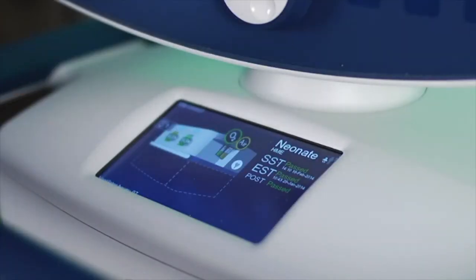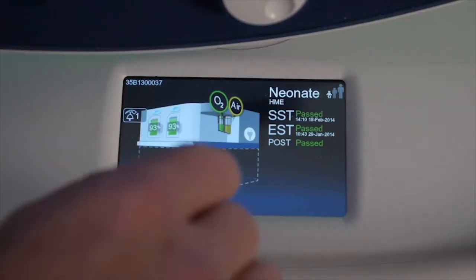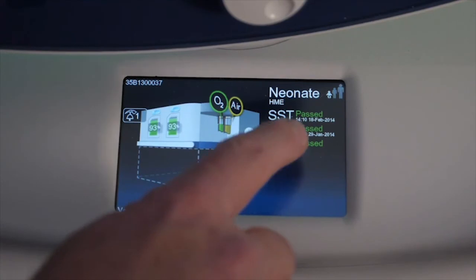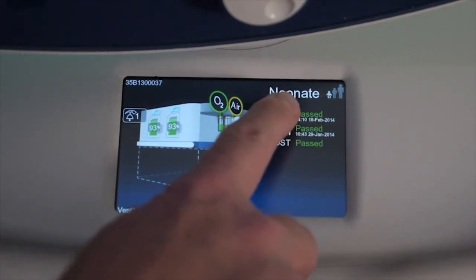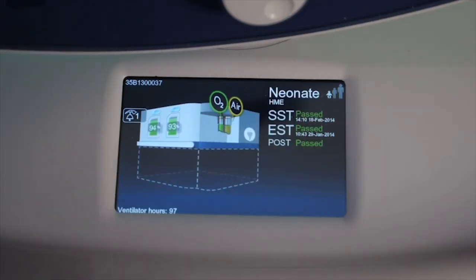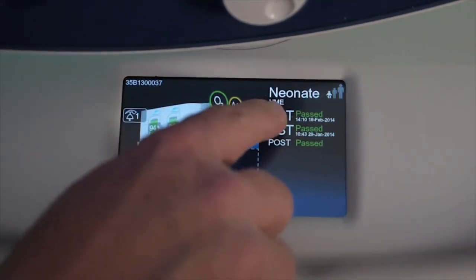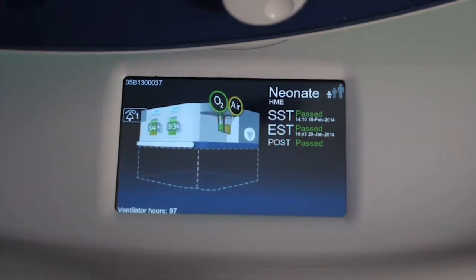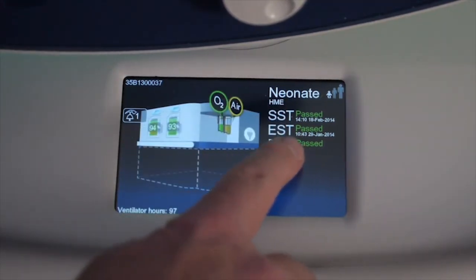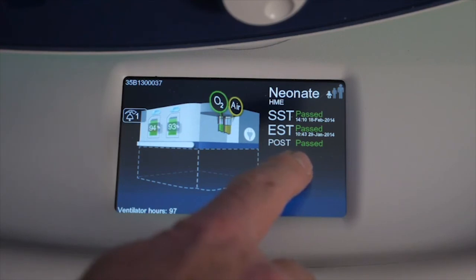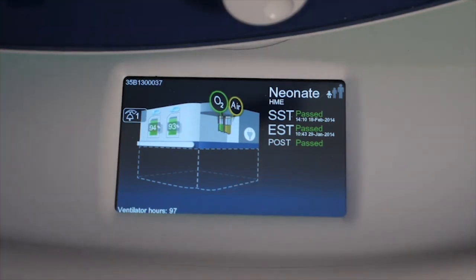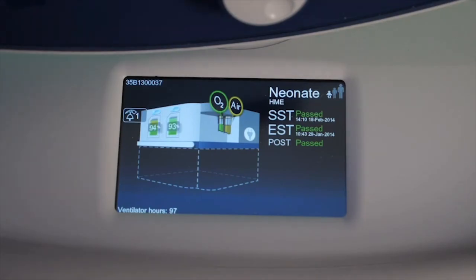Now that we have powered the ventilator back up, I have some other pieces of information. On the top right-hand side, you'll see that it says neonatal circuit size. It's an HME approach, and then it tells me that I've passed the SST, the EST, and the post — or power-on self-test. So you see what appears when you first turn the machine on, as compared to during normal operation.